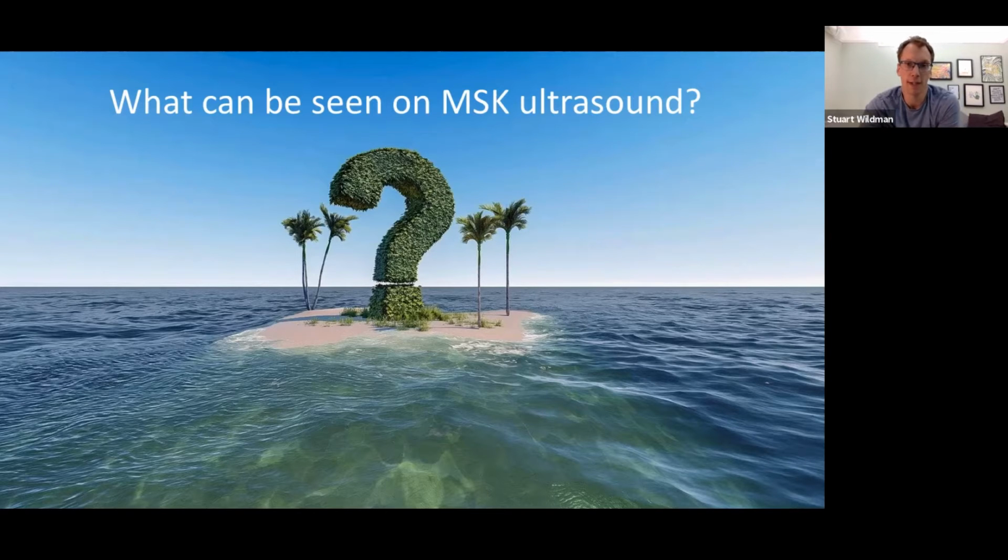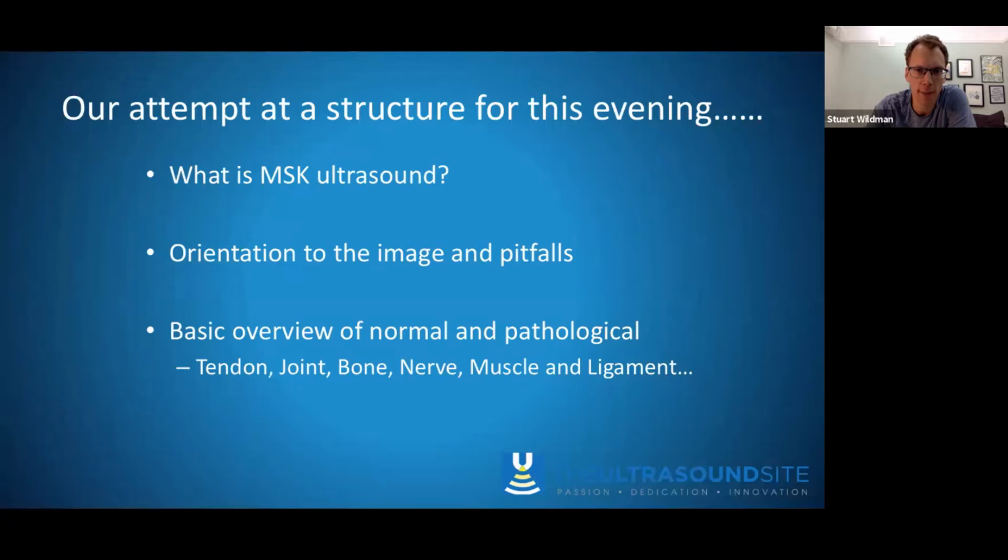So what can be seen on musculoskeletal ultrasound was the topic of tonight's webinar. And I thought it'd be nice on a dark, and actually it's been quite a wet day here in the UK, April evening, to have a nice sunny tropical island to look at. So what can we see on ultrasound? And we'll take you on a bit of a journey through this now, hopefully over the next 45 minutes to an hour. So an attempt at a bit of a structure for the evening, so that we manage to keep ourselves a little bit in check about what we're talking about.